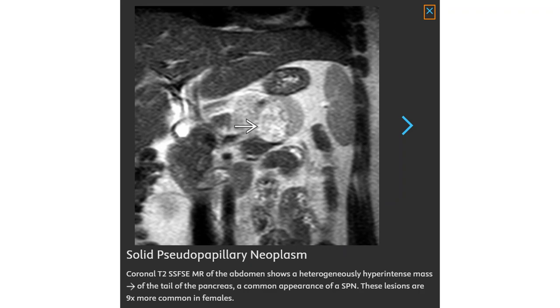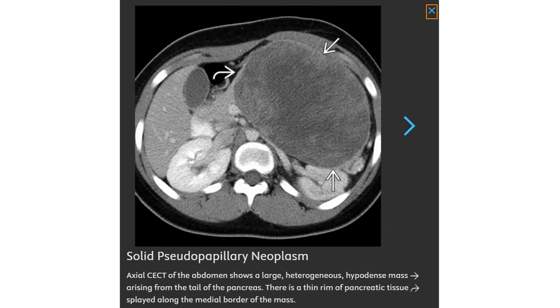Coronal T2 SSFSE of the abdomen shows a heterogeneously hyper-intense mass of the tail of the pancreas, a common appearance of a solid pseudopapillary neoplasm. These lesions are 9 times more common in females. Contrast CT of the abdomen shows a large heterogeneous hypodense mass arising from the tail of the pancreas, with a thin rim of pancreatic tissue splaying along the medial border of the mass.